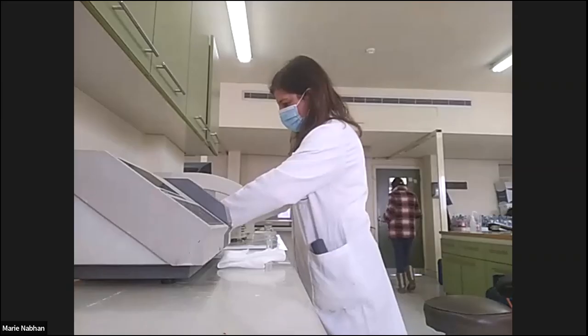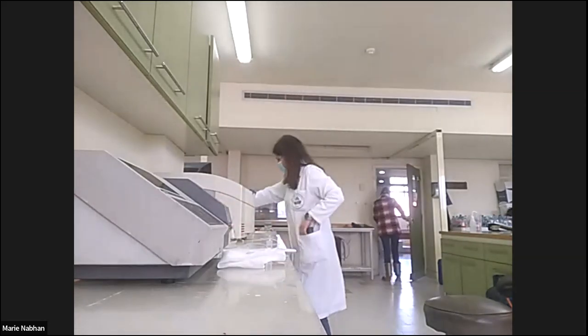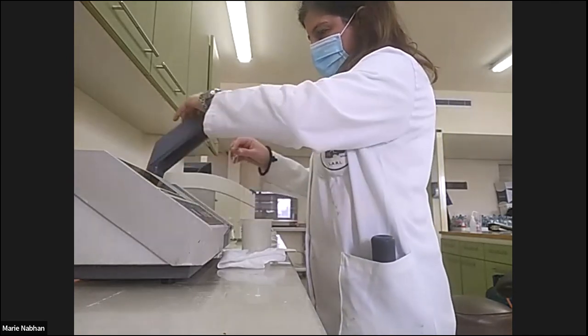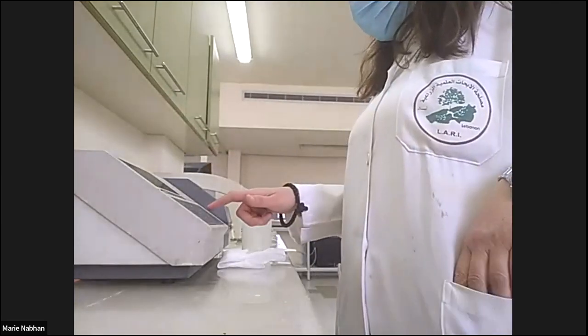I don't know if Dr. Talal can give us the result. How much? The wavelength is 650.